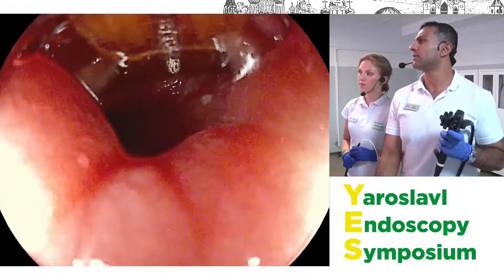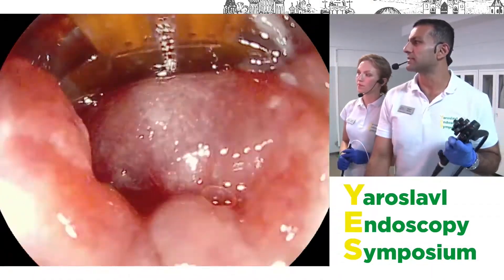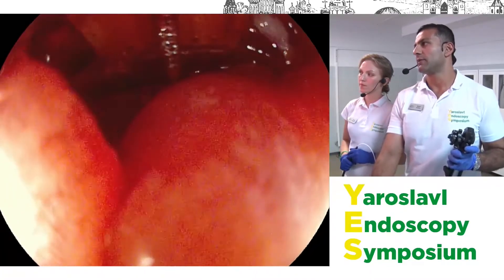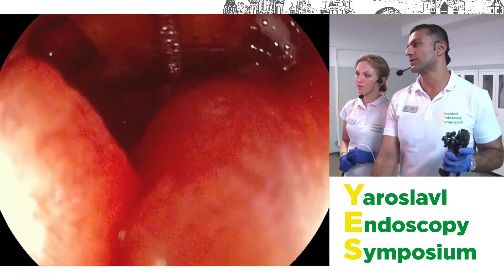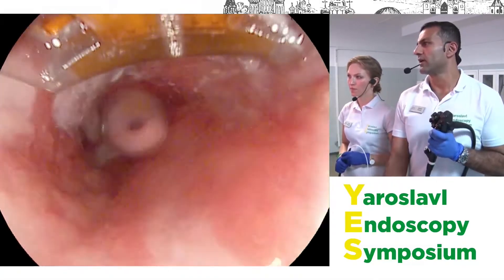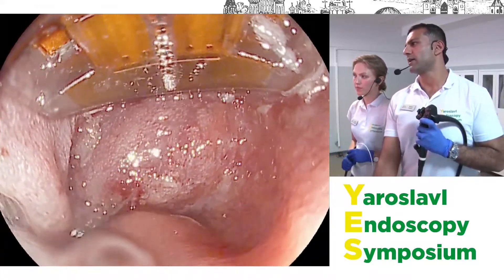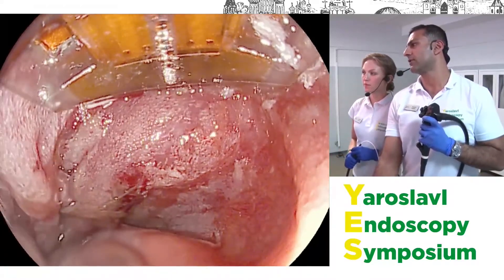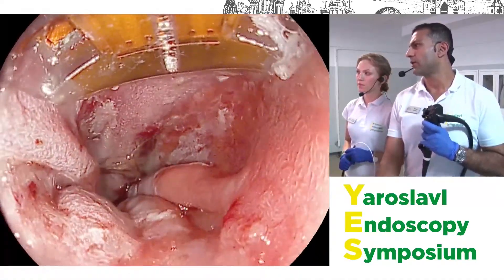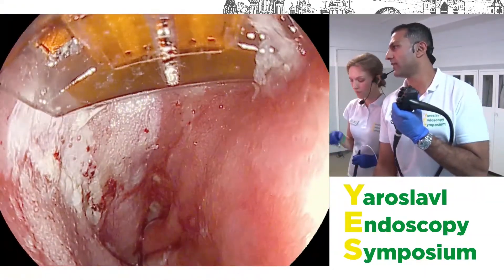You can see we've ablated the entire gastroesophageal junction, including all the way into the cardia — that's the difficult bit. Then you just come up and ablate the rest of the Barrett's almost like painting the esophagus, overlapping the areas you've treated. You don't want to overlap too much because over-ablating increases the risk of stenosis and stricturing. Once the GEJ is done, this next part is really very straightforward.